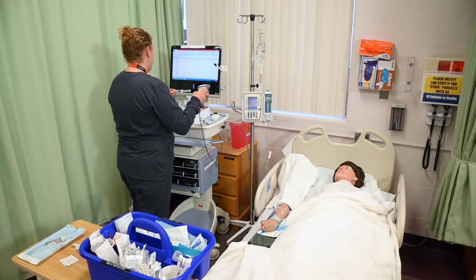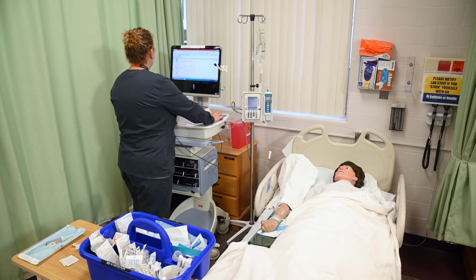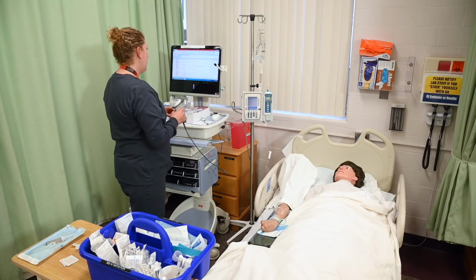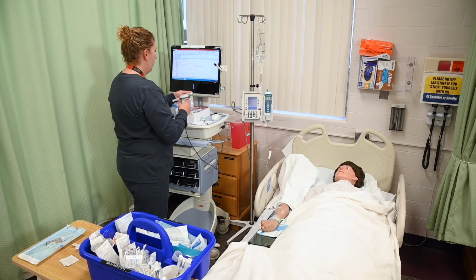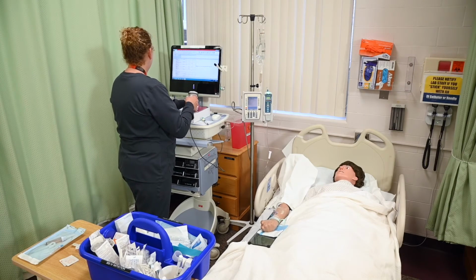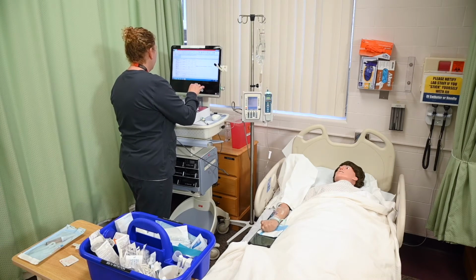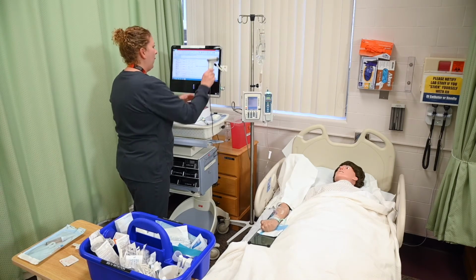And I have 0.9 sodium chloride flush syringe, 10 ml. IV practice, date of birth 3/3/87. 0.9 sodium chloride, 10 ml IV push, PRN flush. And I have 0.9 sodium chloride, 10 ml IV flush.